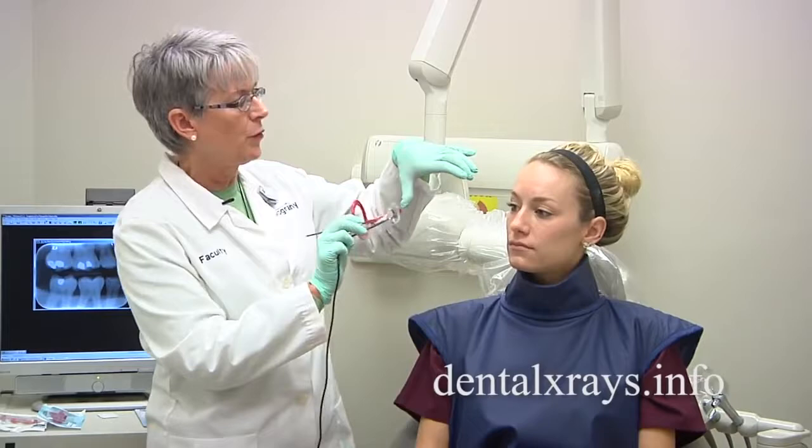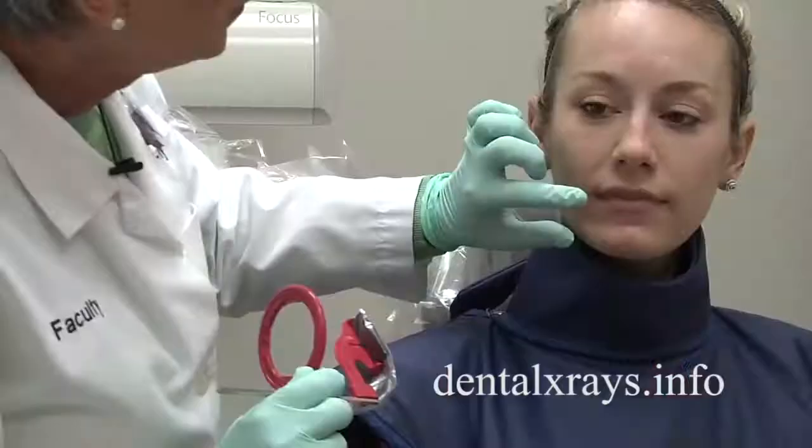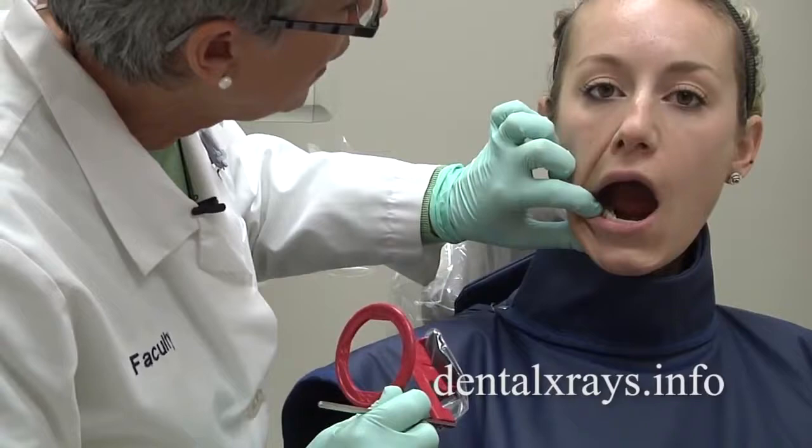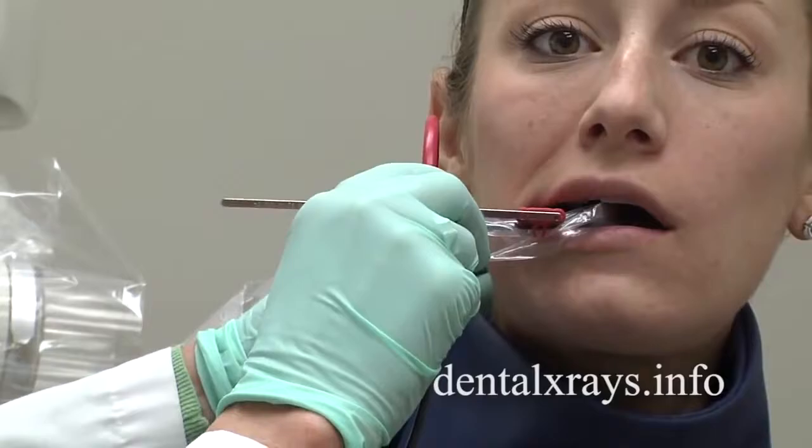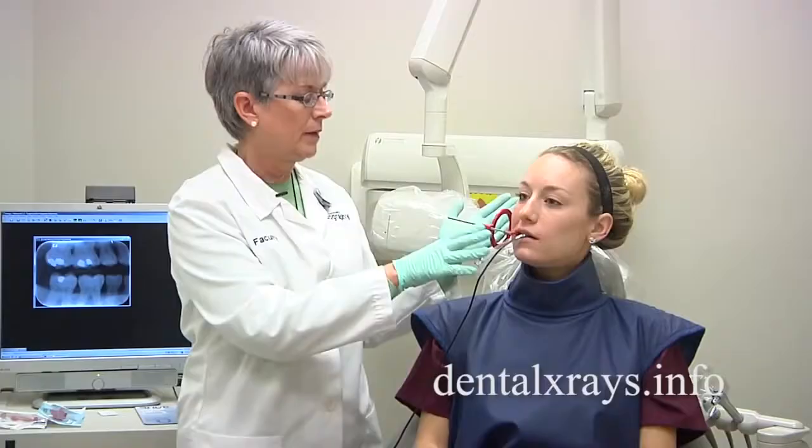You're going to have to move it toward the middle of the patient's mouth where the arch is higher. Often the molar view isn't going to require anything except moving it toward the middle, putting the distal of the second molar on, having the patient bite down, bringing the cone, and taking that. That's all you need to do for the molar view.